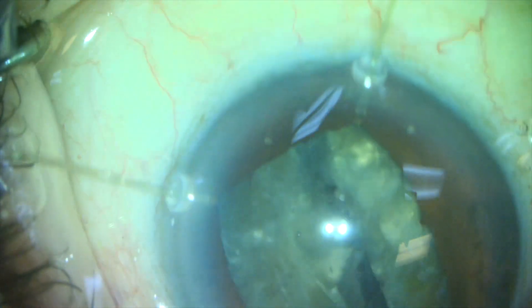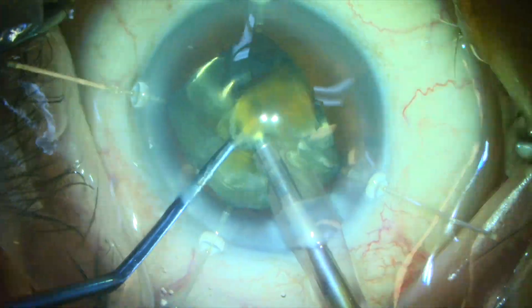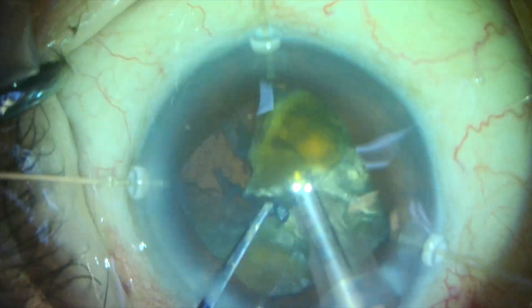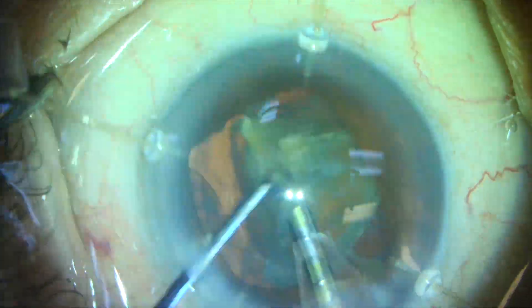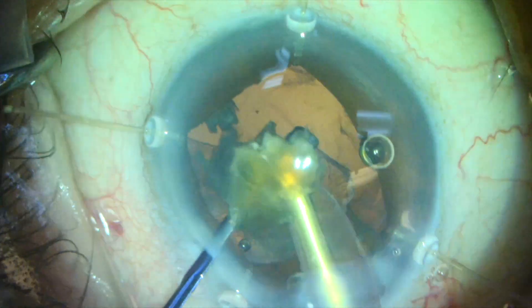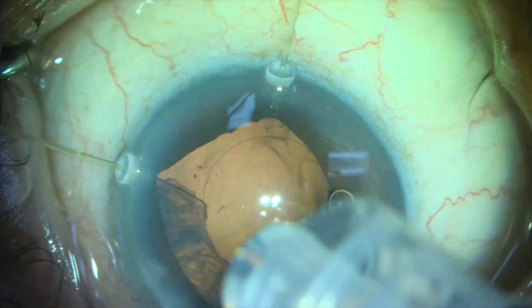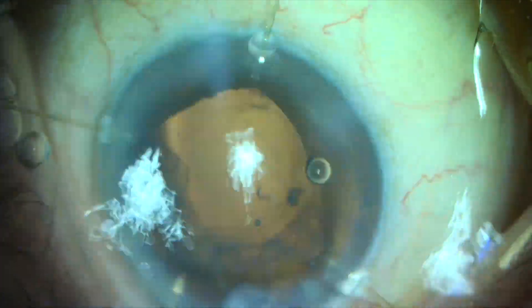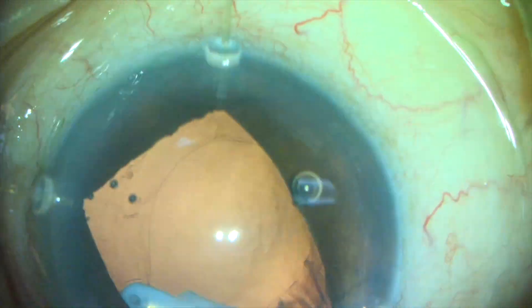Once we've broken the lens into two hemispheres, we can chop it more easily. So really we use the pre-chopper to split the nucleus in two, much like one would use the MyLoop — but I believe this Inamura pre-chopper exerts far less stress on the zonules. MyLoops are about $150 each. The Inamura pre-chopper is about $950 with taxes and shipping, but it can be reused many times. I think over the long term, the Inamura pre-chopper offers an excellent alternative that may be more cost-effective than the MyLoop for removing these dense root beer brown or black cataracts.